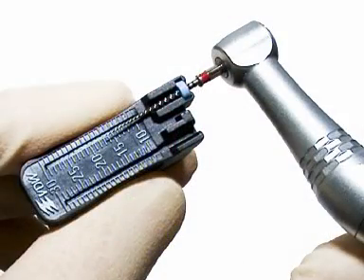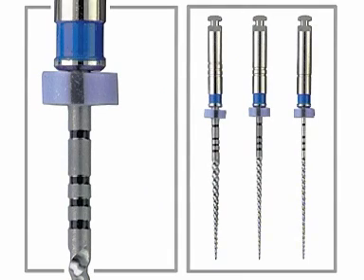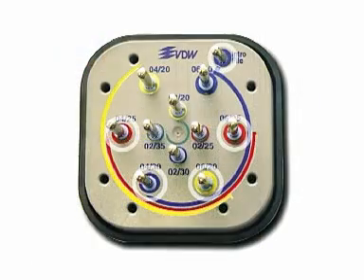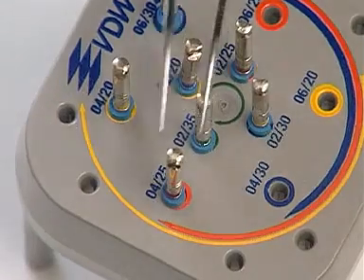The exact working length is set with silicone stoppers on all FLEXMASTER files. The depth ring markings on the instrument itself can also be used for reference. They are at 18, 19, 20, and 22 millimeter. The last file in the red sequence is the 0425.